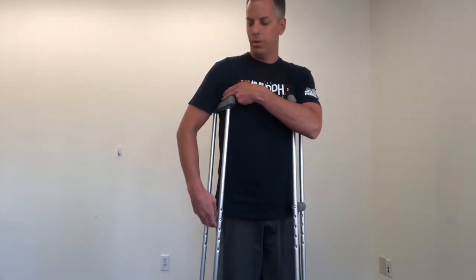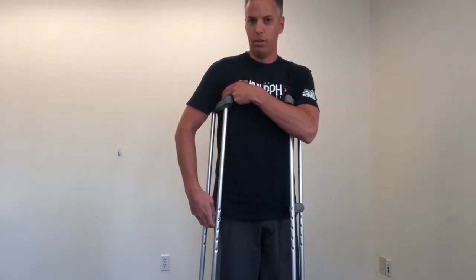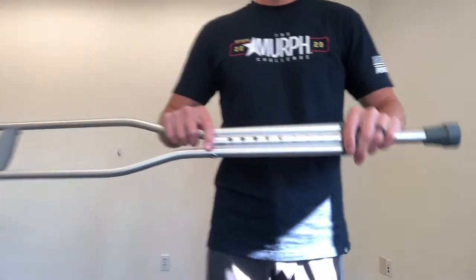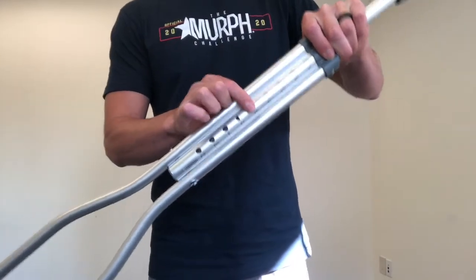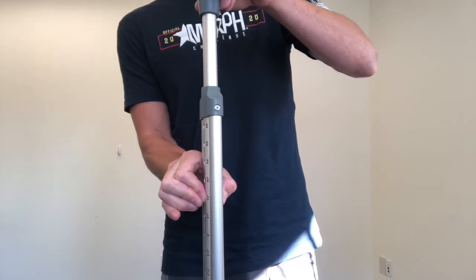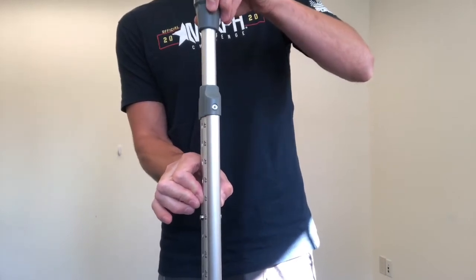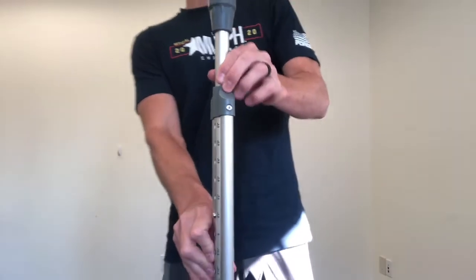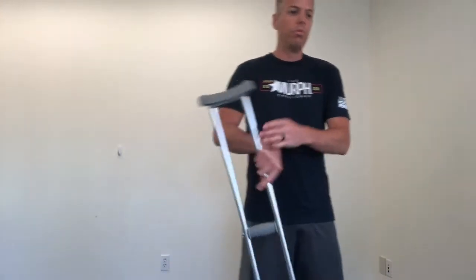What we want is at least an inch or two finger widths between the top of the crutch and the armpit. These are too high, so I'm going to adjust to make them smaller. To adjust, all you have to do is push the pins in on either side, then make it shorter or taller depending on what you need. Absolutely make sure you hear that click — that means it's locked in place and it's not going to move.